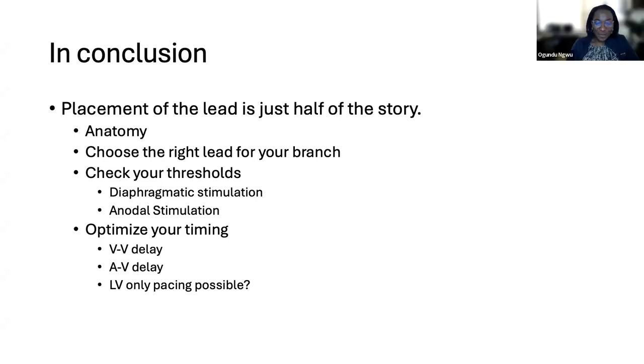Oh, that's a good question, because I used to look at that a lot with my Medtronic devices, and then recently I got a report from my device tech that gave me BiV pacing and then trigger pacing. I think it was with an Abbott device. I didn't even know that it also had that algorithm.